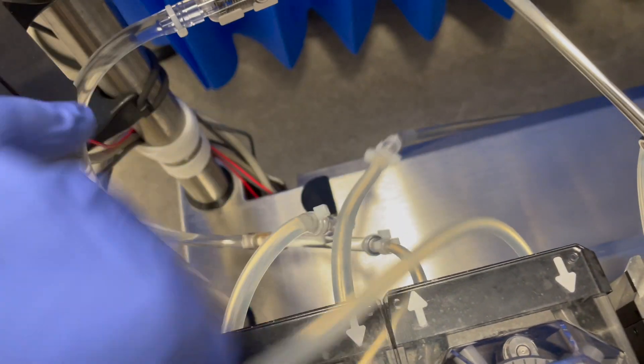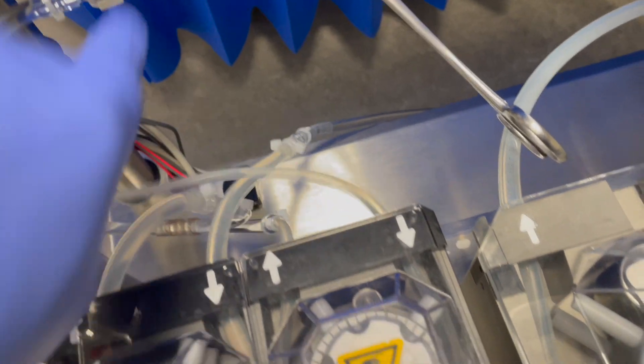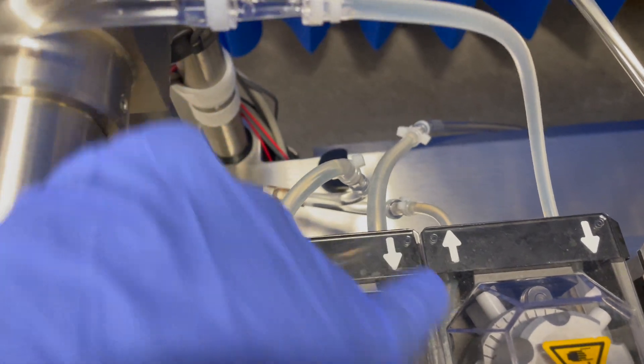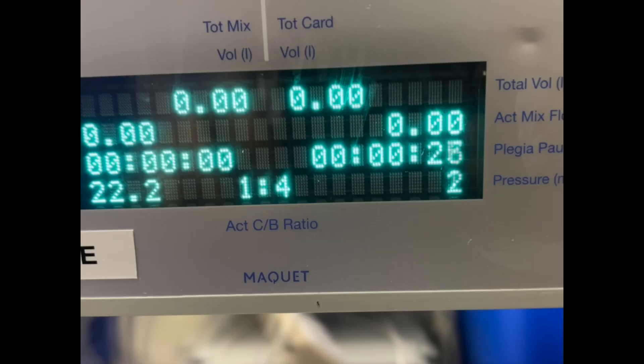Once fully primed, make sure the plegia pump is slave to the main arterial pump. Also confirm the cardioplegia pump is slave to the blood pump. Confirm the blood to plegia ratio — standard configuration is four to one: four parts of blood and one part of concentrated cardioplegia.